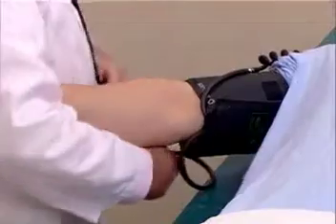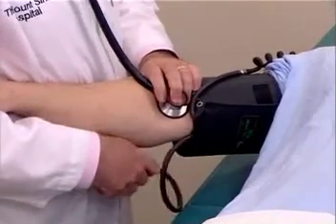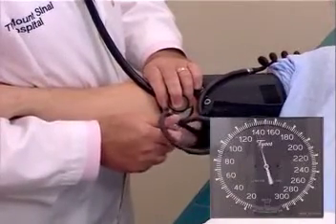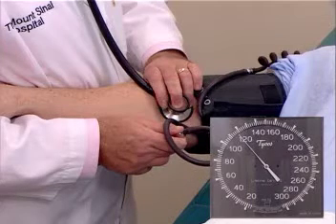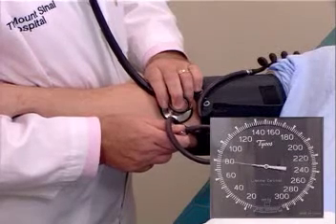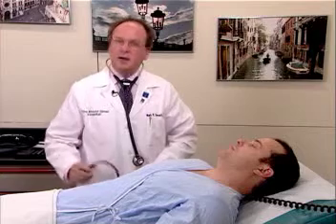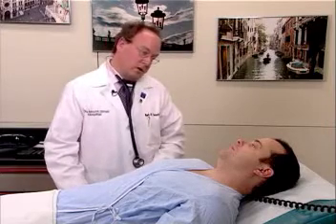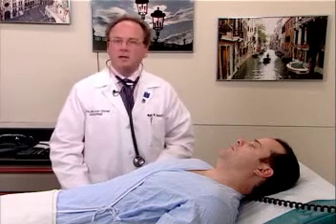We will place the diaphragm of the stethoscope over the brachial artery and blow up the blood pressure cuff to about 15 or 20 millimeters higher than that which we palpated. I'm going to blow up the blood pressure cuff now to about 140, and now very slowly I am going to reduce the pressure. The first sounds were heard at 120. The point of muffling was at 80, and the point of disappearance was at 75. Mr. Johnson's blood pressure is 120 systolic, 80 is the point of muffling, and 75 is the point of extinction. It's very important to measure blood pressure to the nearest 5 millimeters of mercury, because if you were to say a blood pressure would be 127 over 79, this implies a false sense of accuracy of the determination.